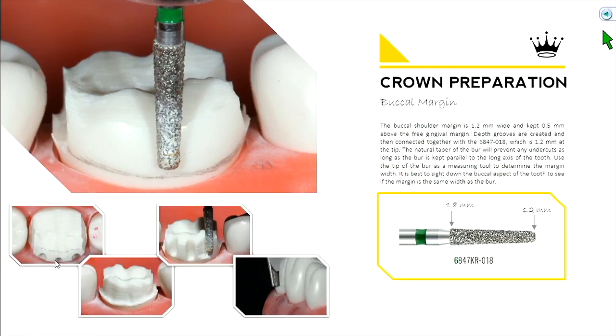Orientation grooves are helpful but not completely necessary for buccal reduction, since you can always see where your margin is — unlike occlusal reduction where you lose reference once you shave a little off. Here you can always look at your margin and measure if you're at 1.2 mm. For some of us, it's easier to skip the orientation groove because connecting grooves can create a wavy margin contour. After a few attempts you'll figure out what's most helpful.